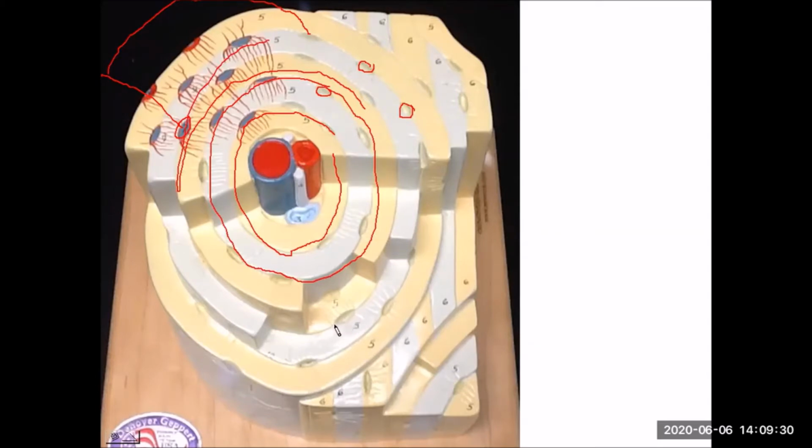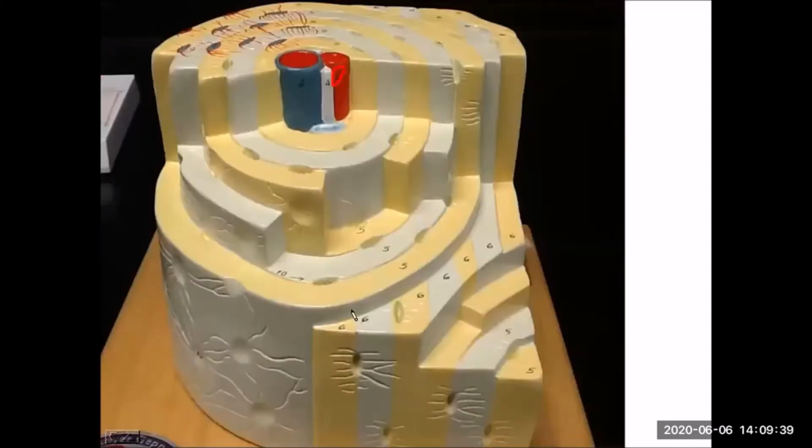And then taking a closer look at a single lacuna, you can see the canals that branch off of it. And this has a better perspective. This is the appearance of the canaliculi. And it really means tiny canals that branch off of a single lacuna. So here's a really good example, seeing multiple canaliculi and the lacuna they connect to.